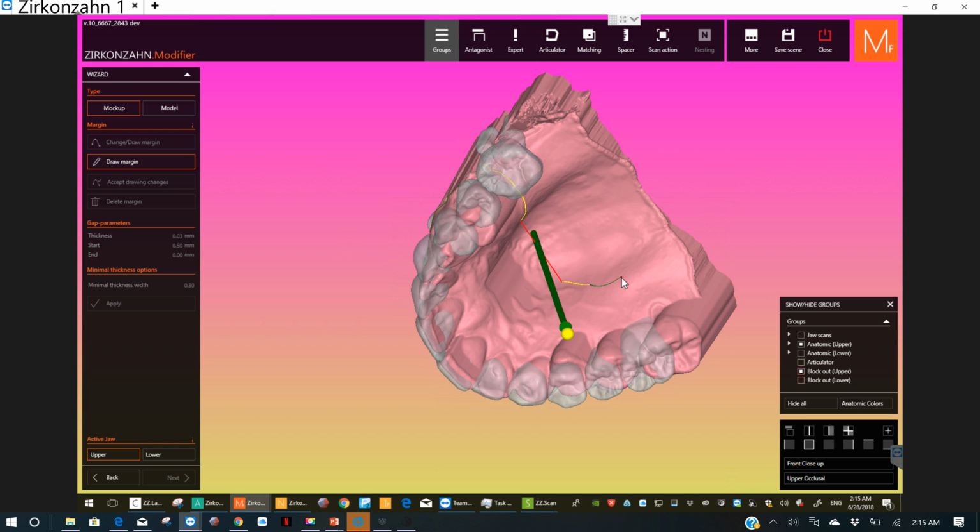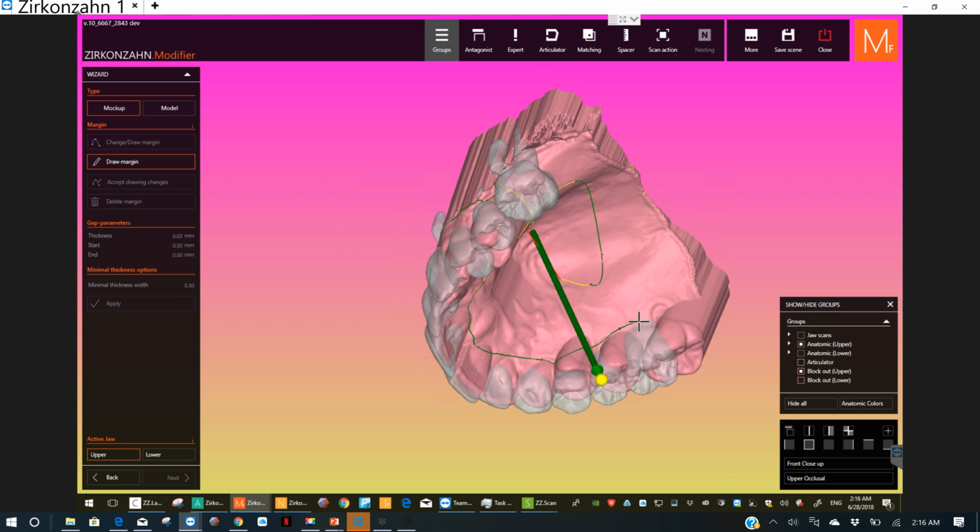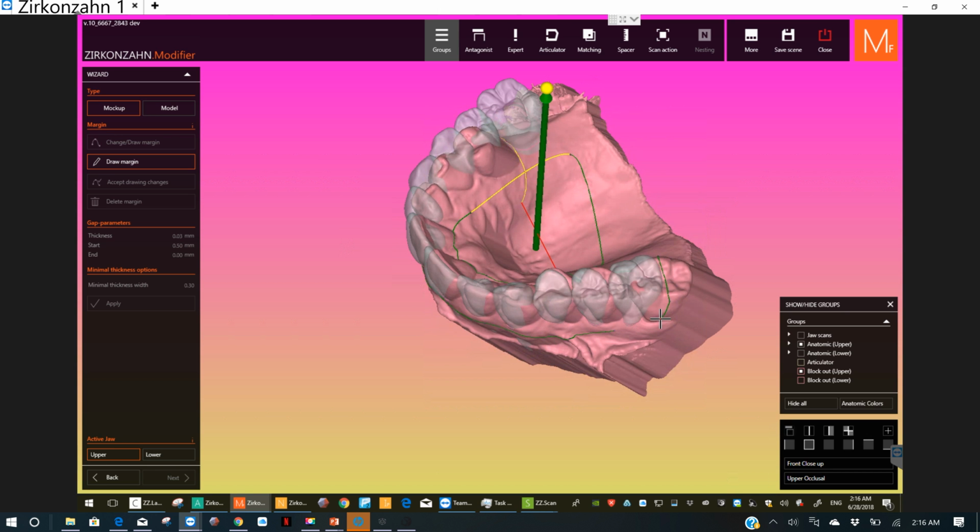Oh, that sucks. Yeah, I didn't know I was going to do that. So if you do that, you have to see, I can fix it. So if I come around here, I was hopefully going to give them a little ice skating rink that they could kind of start getting used to, and maybe almost act as a deprogrammer so their jaw joint could start healing. Maybe get their sleep apnea a little better, jaw in a better spot, spine in a better spot.